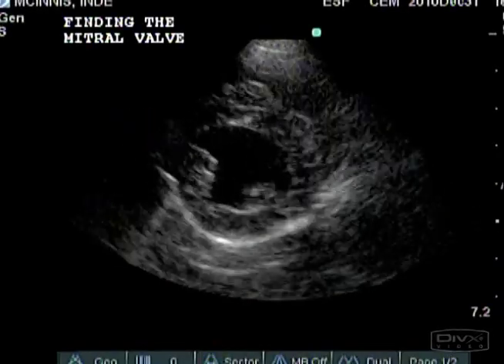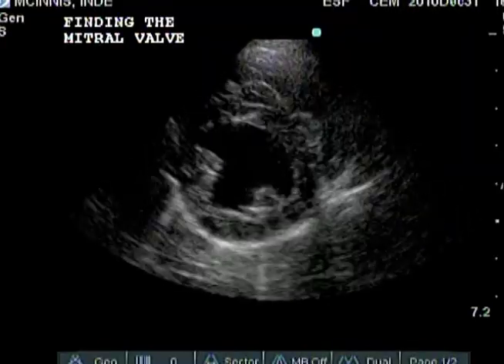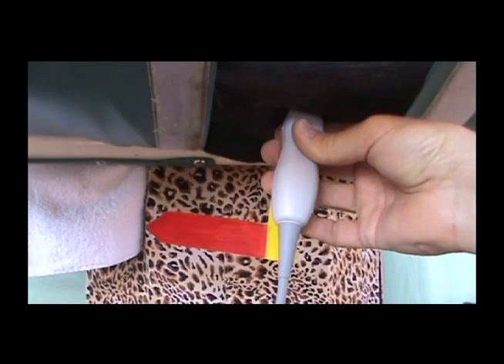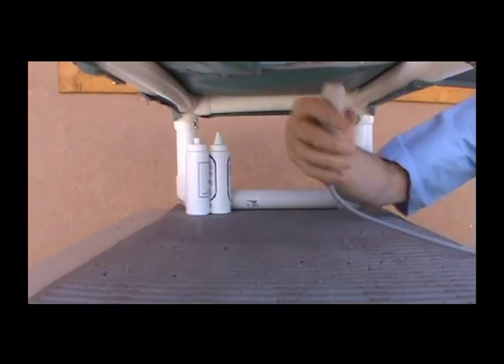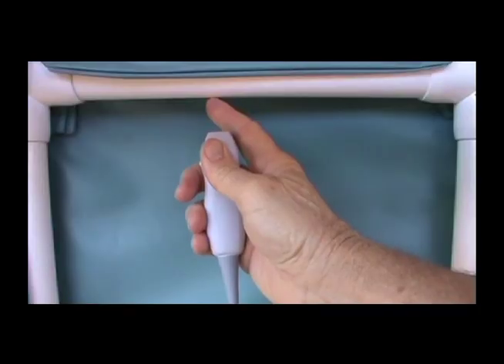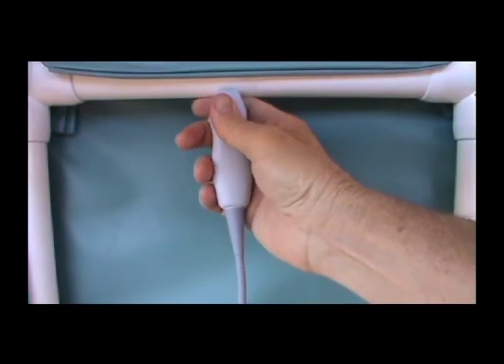Start with a right side short axis view of the left ventricle. The transducer is held perpendicular to the right thorax. Remember to anchor your elbow to the rubber mat and anchor your index finger to the patient's body to prevent unintentional image drift.